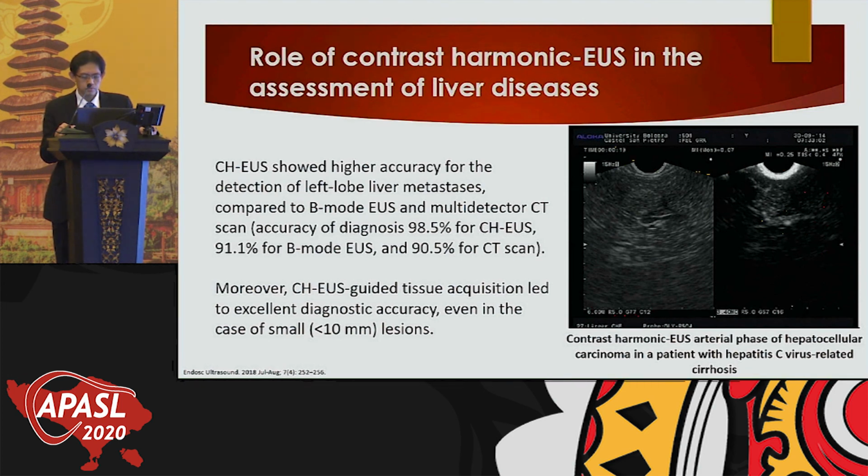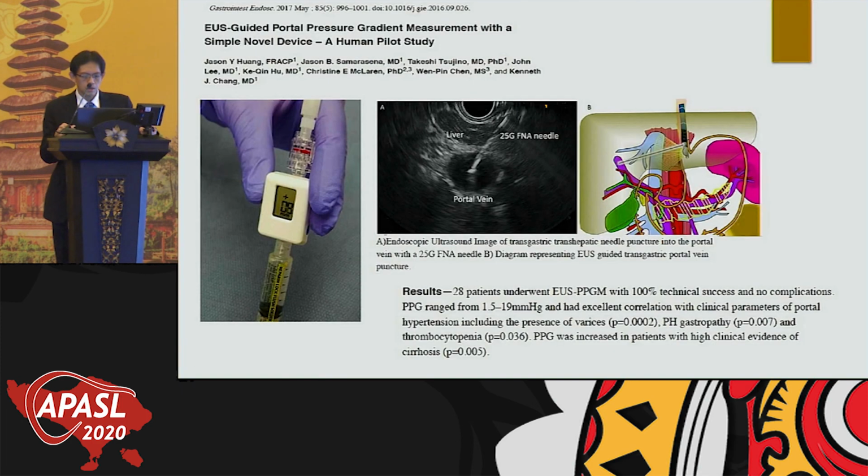And I think the last one, a very recent study, used the EUS to do portal pressure measurement with a simple novel device, and they showed that this is quite accurate to measure the portal pressure when the patient is also sedated.